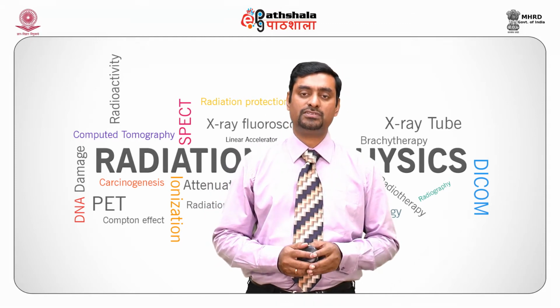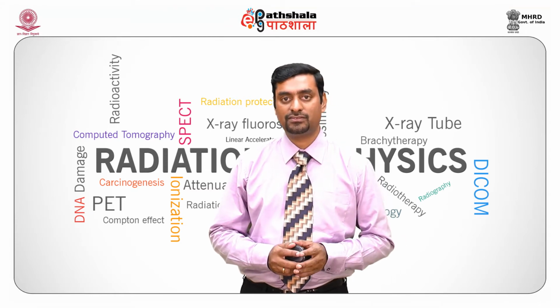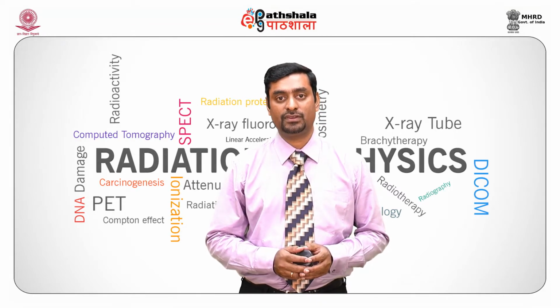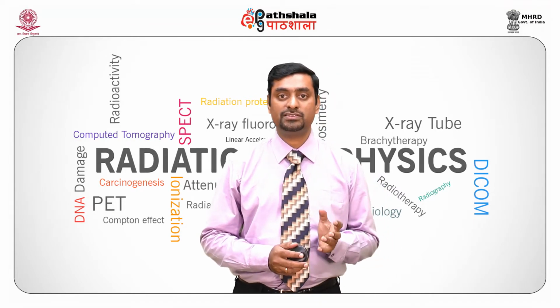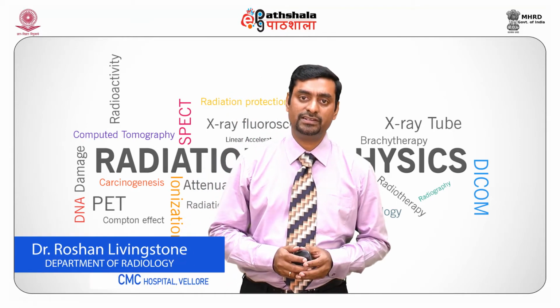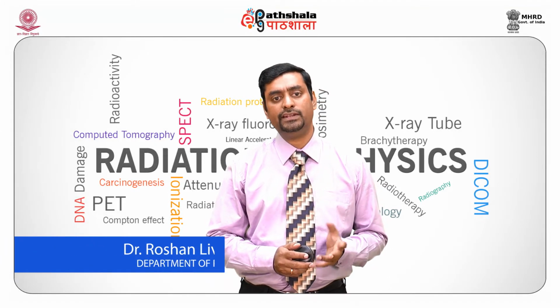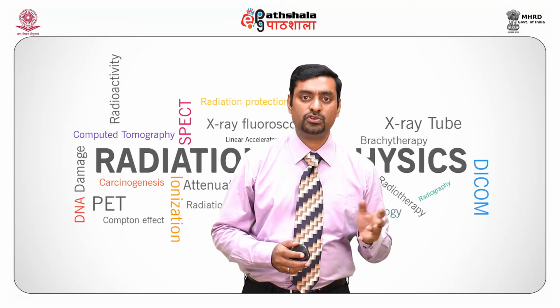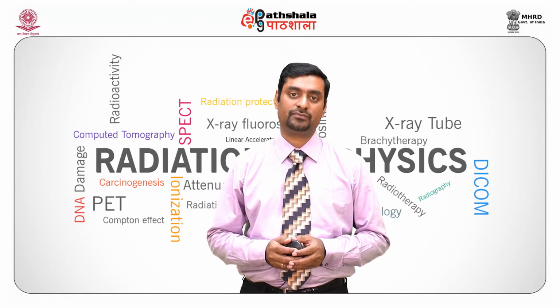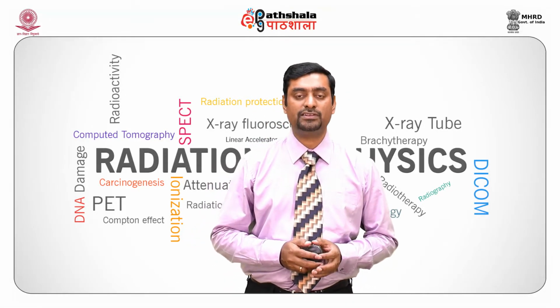For mammography purposes, we need high resolution CR cassettes. Hence, the packing factor for the phosphor which is used for CR should be very high. The image resolution we are considering for mammography is about 100 microns. Hence, CR readers come with 100 micron pixel size. In a dual side reading CR reader, the resolution can go up to 50 microns. It is very good for image quality. The cost of these CR readers is less than flat panel detectors.